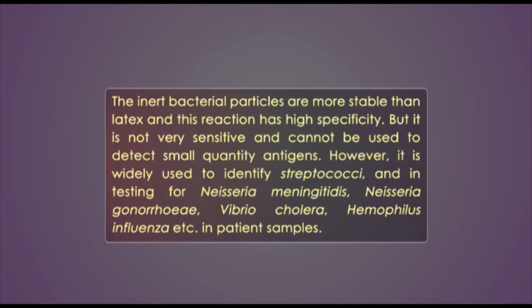The inert bacterial particles are more stable than latex and this reaction has high specificity, but it is not very sensitive and cannot be used to detect small quantities of antigens. However, it is widely used to identify streptococci and in testing for Neisseria meningitidis, Neisseria gonorrhoeae, Vibrio cholerae, Haemophilus influenzae, etc. in patient samples.